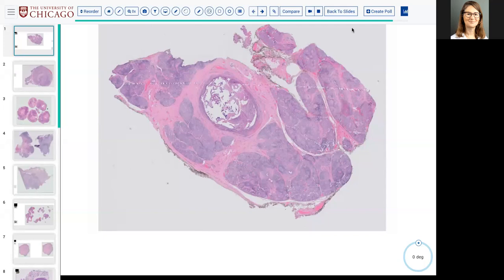I think this presentation has both some classic bread and butter things as well as some variations and some important, high-grade, distinct things. So hopefully you had at least some chance to look through the slides. If not, no worries. We will just describe as we go. And it looks like there are enough of you on that I'm going to see if someone wants to talk about number one.